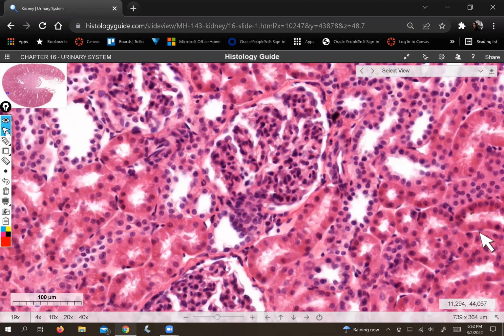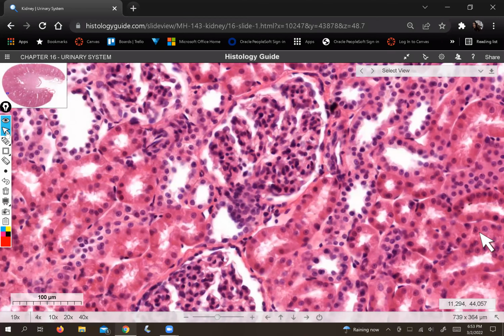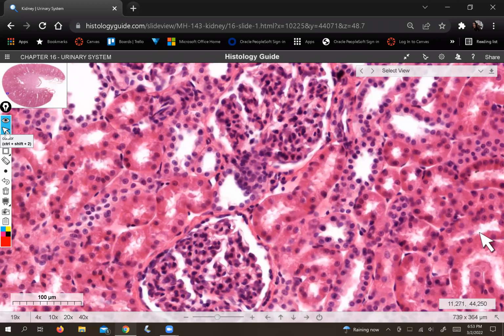Okay, so the difficulty of this tissue is that where formerly you were having to look at an epithelium and tell if it was cuboidal or something else, like, oh, it's either simple cuboidal or stratified cuboidal, but probably not because that's rare, or another kind of thing, now you have to look at tubes that are all made of simple cuboidal epithelium and still tell them apart based on other characteristics besides their being cuboidal. So training wheels are well and truly off. You are in varsity level histology.